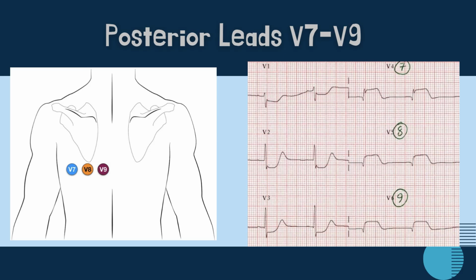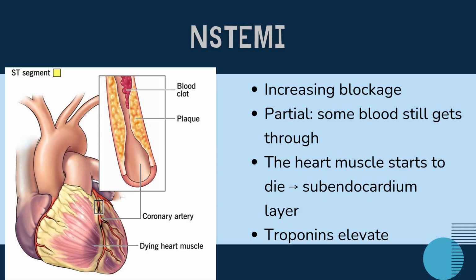And troponins here behave like any other STEMI. They rise because this is still a full thickness infarct. The danger is missing it if you don't think to add those extra leads. Now let's shift gears to an NSTEMI.